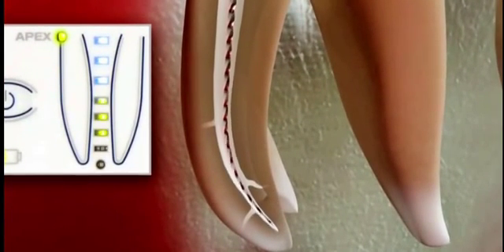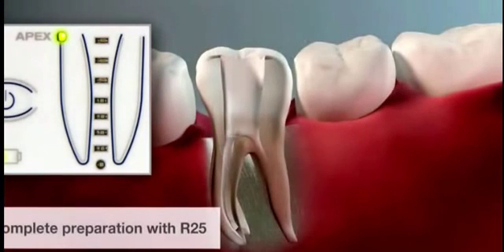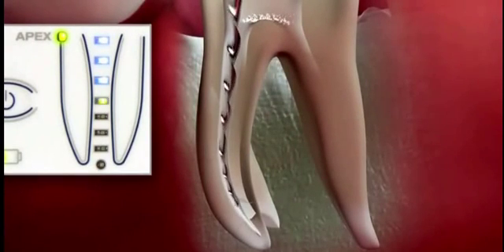Working length is reached when the third green diode illuminates. If the file goes to full working length, preparation can be completed with the reciproc instrument. During preparation of the apical third, you can use the motor's simultaneous length determination function.